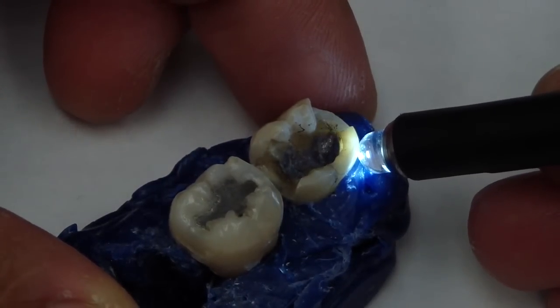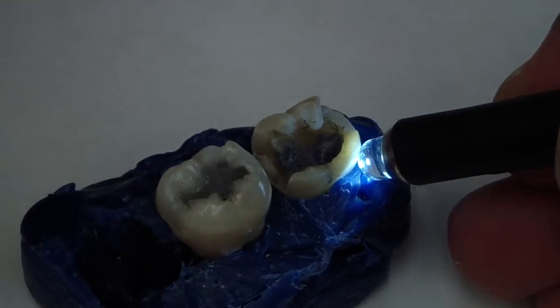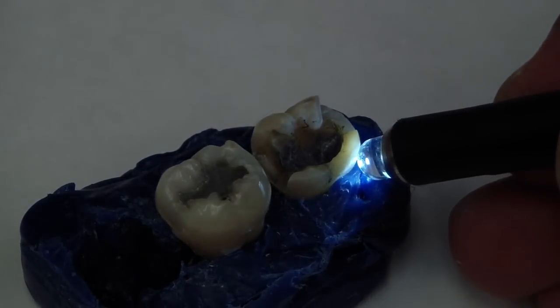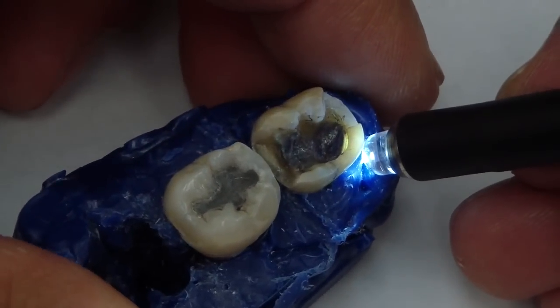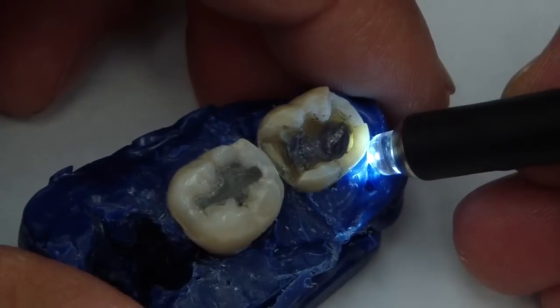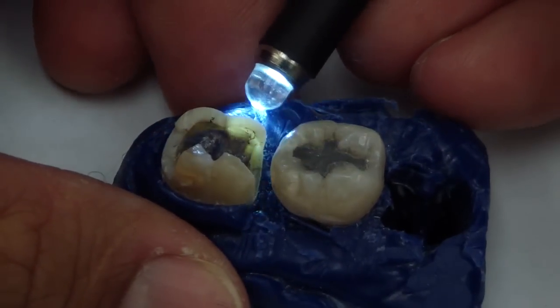Now how do we tell what a fracture is? There are a few different ways. The big concepts are — especially when we've had an amalgam restoration with no bonding agent, and that's controversial as well in terms of aiding the fracture resistance of a tooth. But let's take a look here, and one of the things we're looking for is this crack.